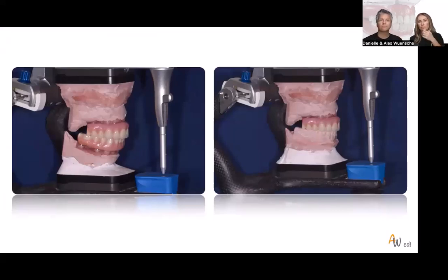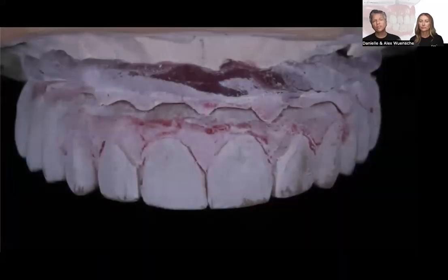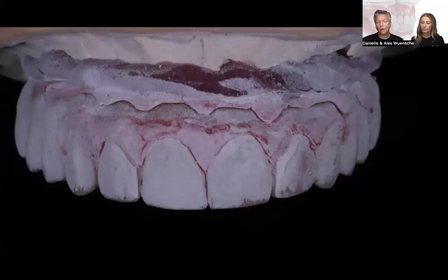You don't have to have taken a bite, right? So that's like the perfect bite here, because these provisionals have been in the patient's mouth for 3 months. They are really adjusted already, by themselves or by yourself, and they're perfect, right? As long as the patient feels comfortable. And then usually what we do here, we digitize the records. Even if you go analog, we often digitize all the records to have them saved, because at some point in the lab, we are going digital with the restoration.